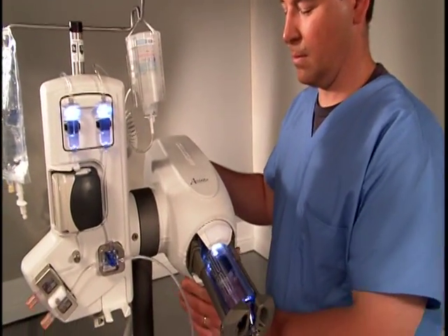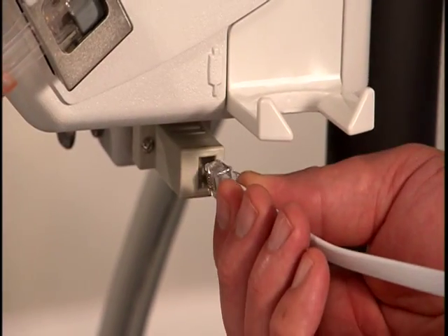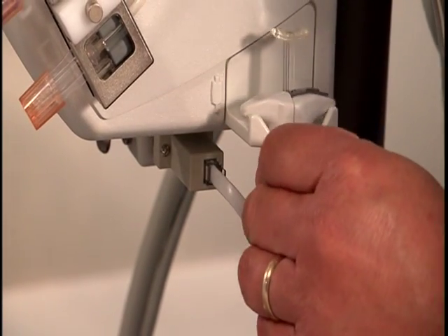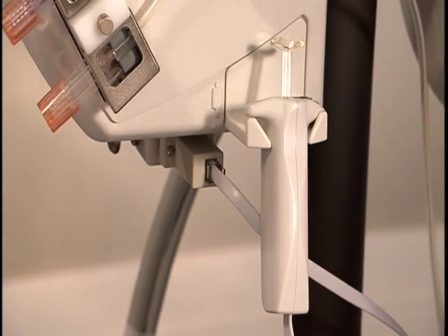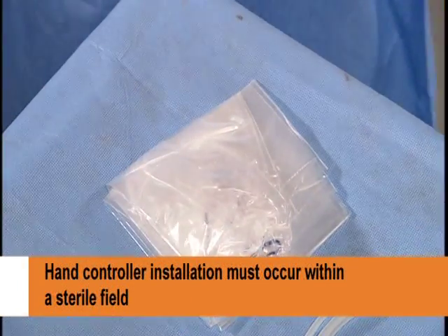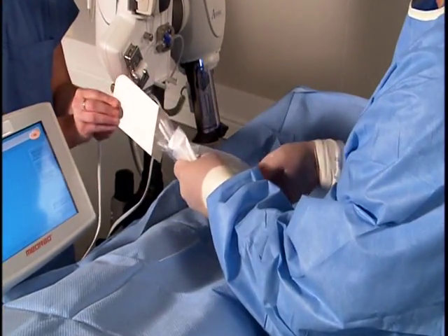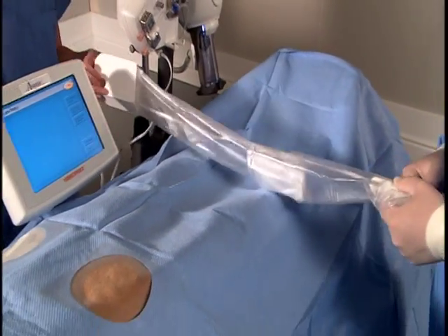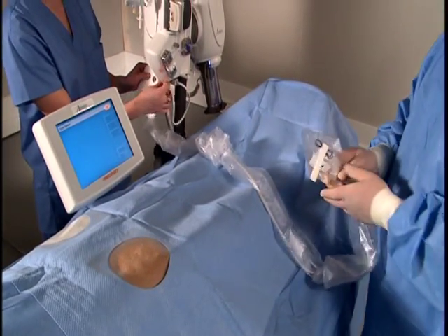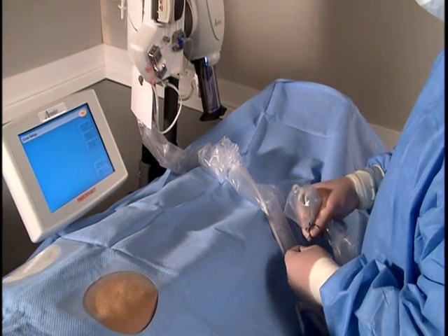Perform Step 6 by rotating the injector head to the down position. Step 7. Install the hand controller on the bottom of the flow control module. The connection works just like a standard telephone jack. Just listen for the click. Hand controller installation must occur within a sterile field to prevent contamination. When a hand controller sterile sheath is used, the hand controller may be used for a total of 5 cases before being discarded. The sterile sheath must be replaced after each use, and the hand controller must be discarded after the 5th case.